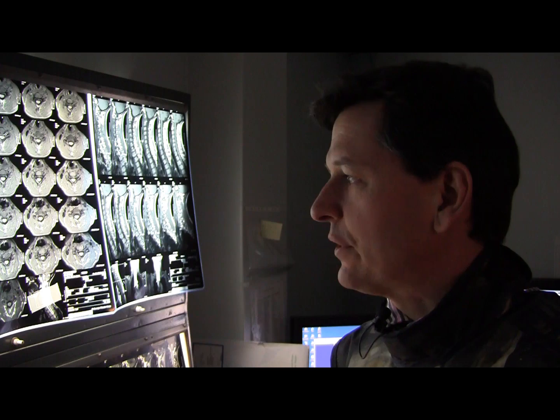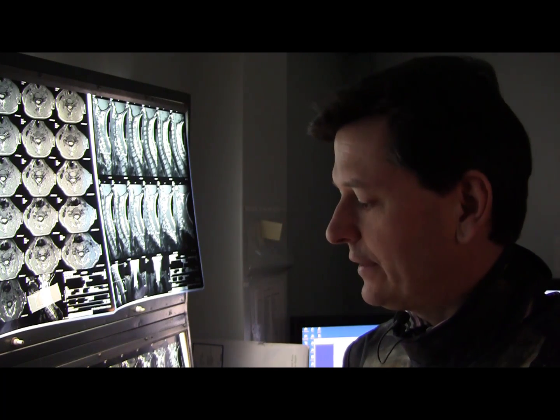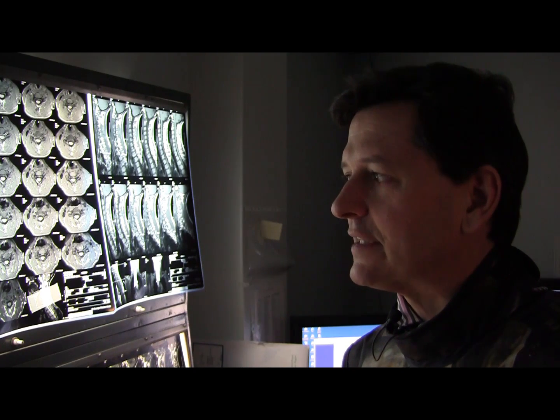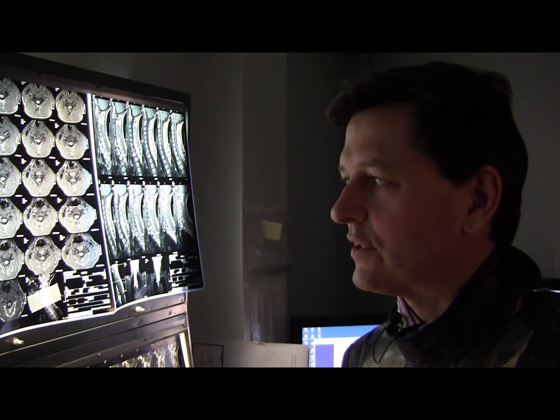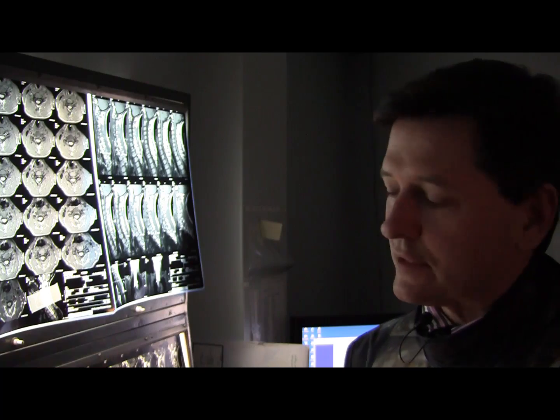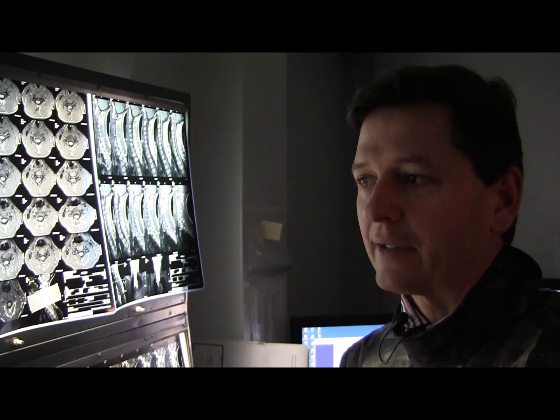We're just doing a cervical nerve root block. This lady has intractable pain in her right arm, and we've been asked by the neurosurgeons to do a right C5-6 intervertebral foraminal injection, which will get the right C6 nerve root. We're going to inject a bit of steroid and a bit of local anaesthetic around the right C6 nerve root. There's not much to see on the MRIs, but she's got pain in its characteristic distribution, so we'll park a little bit of steroid and local under fluoro CT guidance.